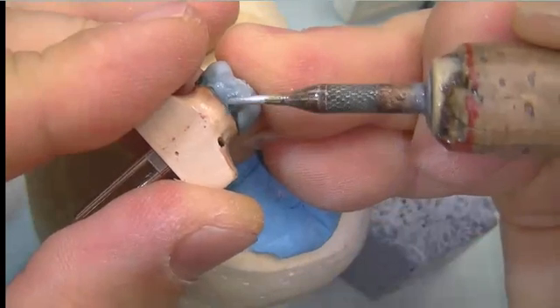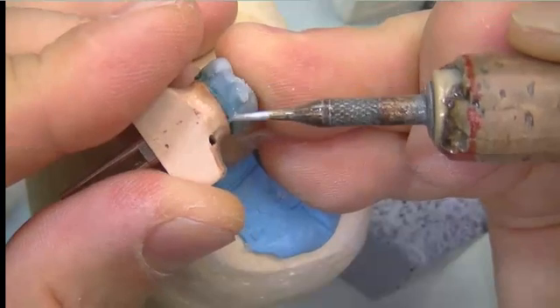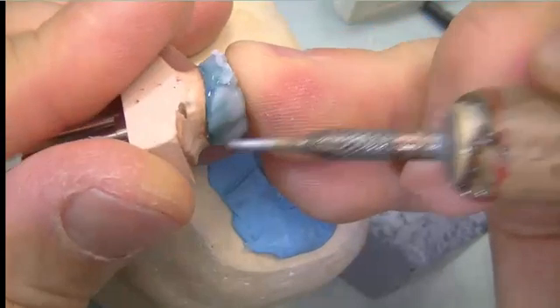The die is now being removed and we are going to start to add the two proximal contact areas and fill up some of the margins there.